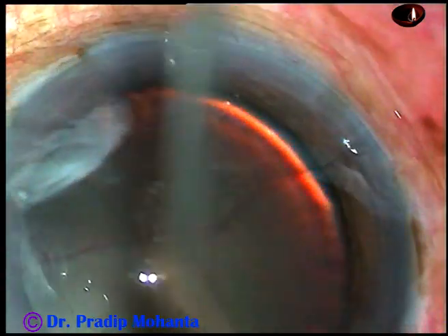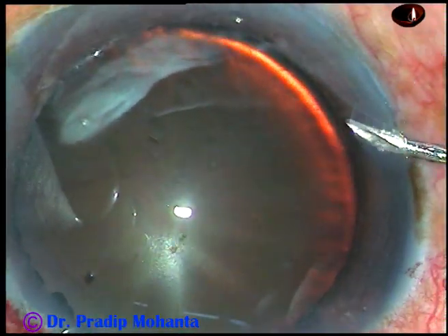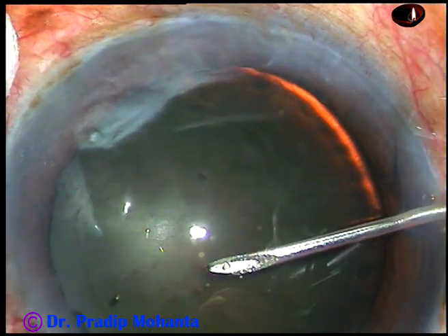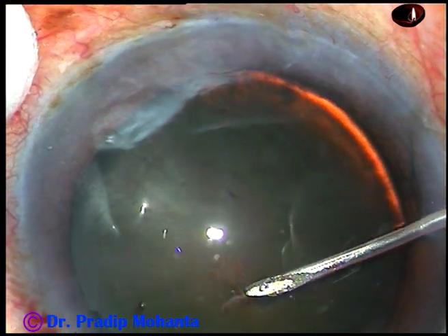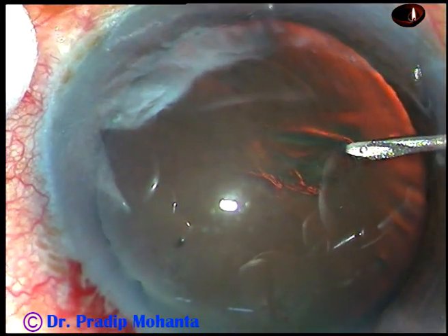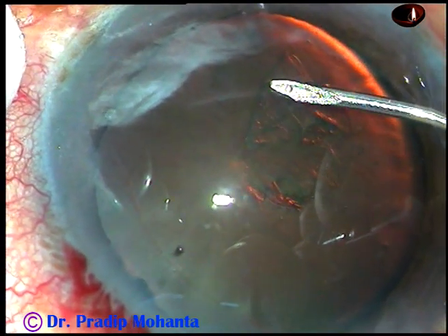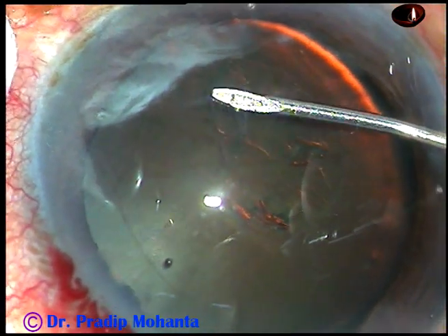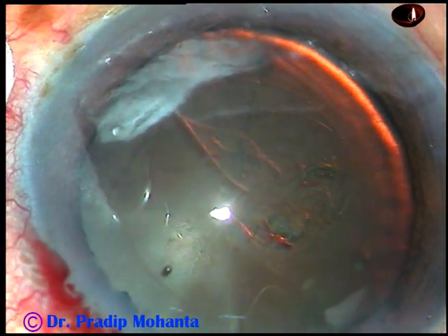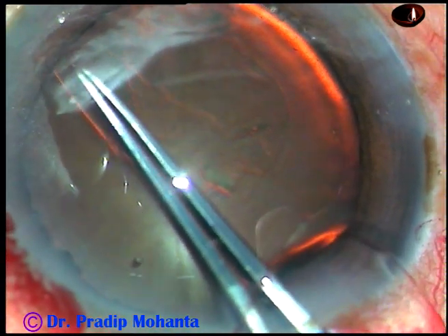Now see what happens as I try to do capsulorhexis. See — the whole lens moves. As I try to incise the anterior capsule, the whole lens moves. This indicates that either there is generalized weakness of the zonule or there is subluxation of a few clock hours.